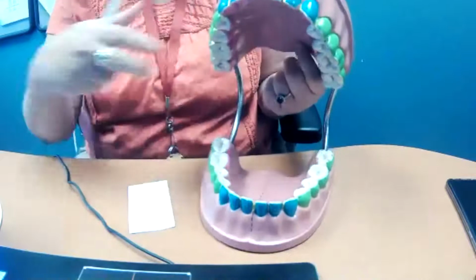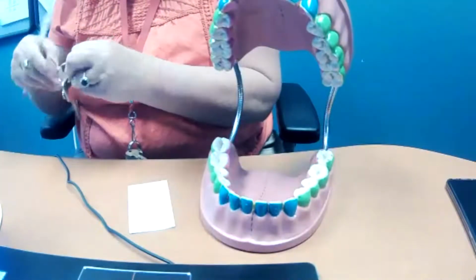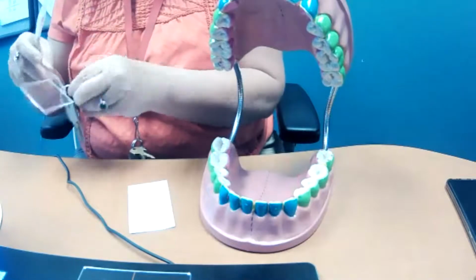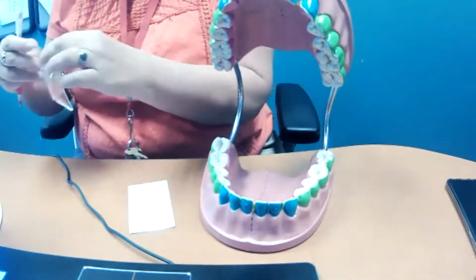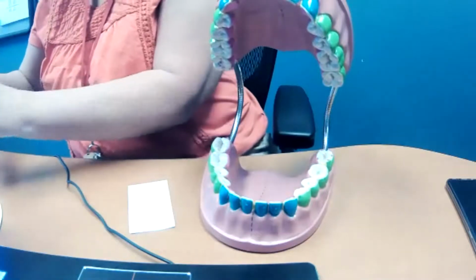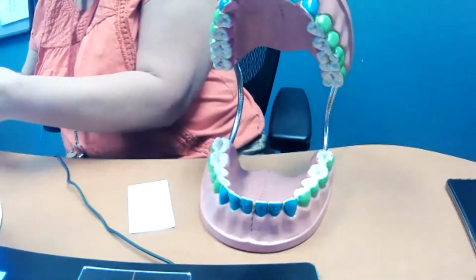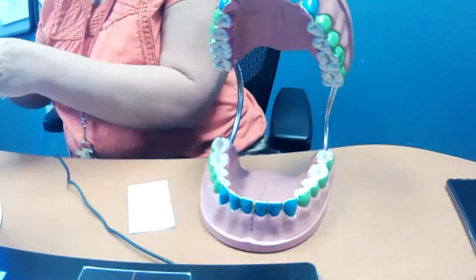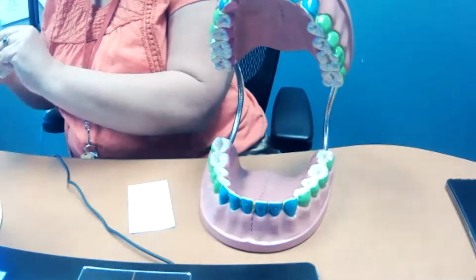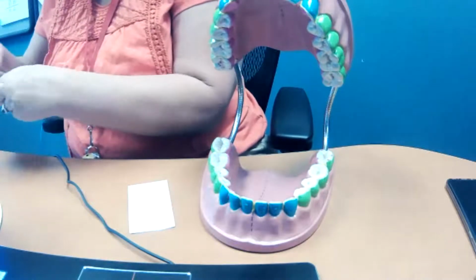It's solid bone. So what happens there is that we have to make sure that we angle the film enough, whether it's digital or whether it's conventional film. And with digital, it's actually a little bit easier because the film actually will not bend like conventional film does.